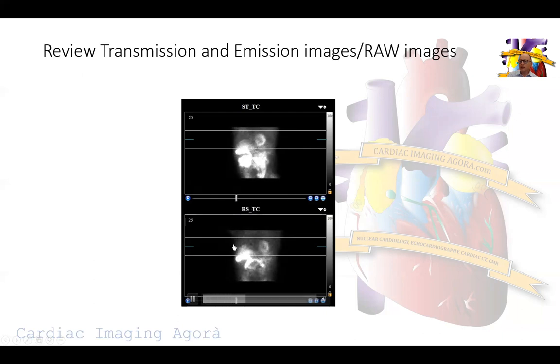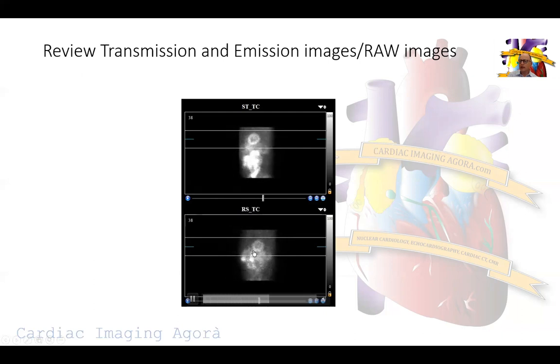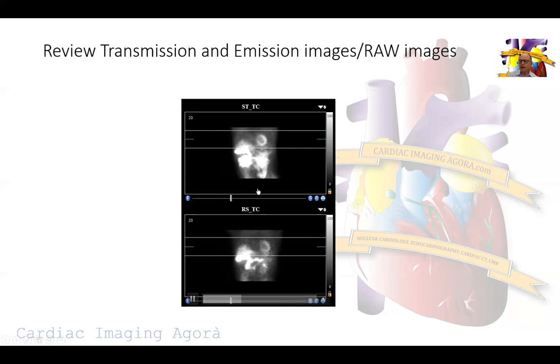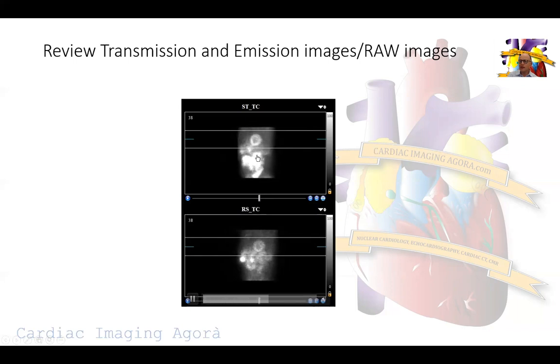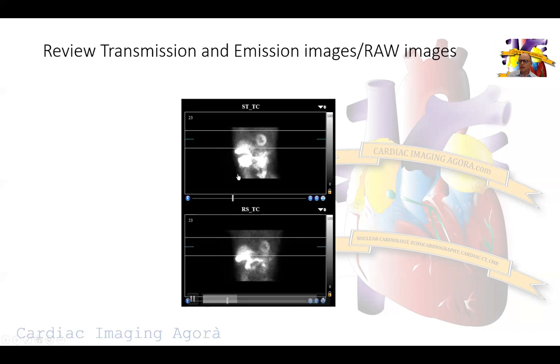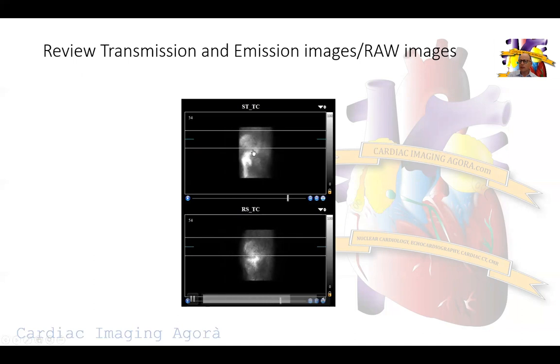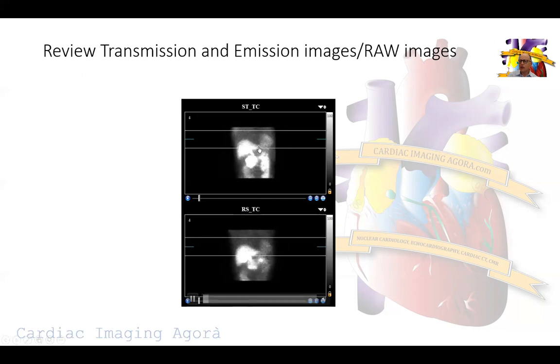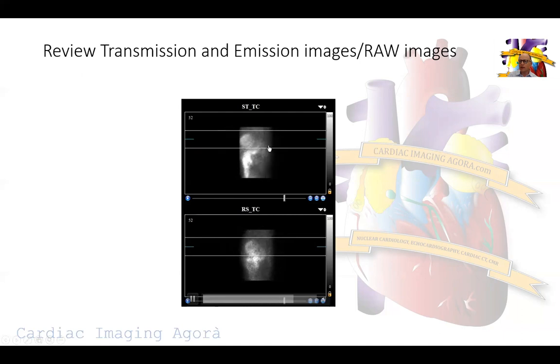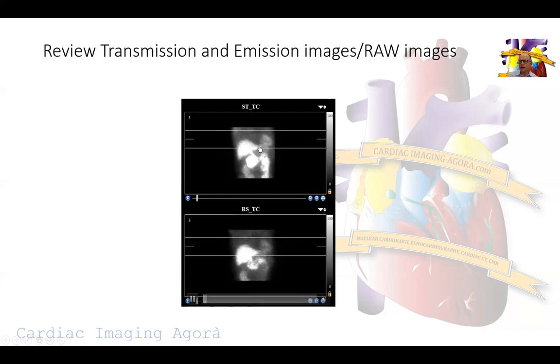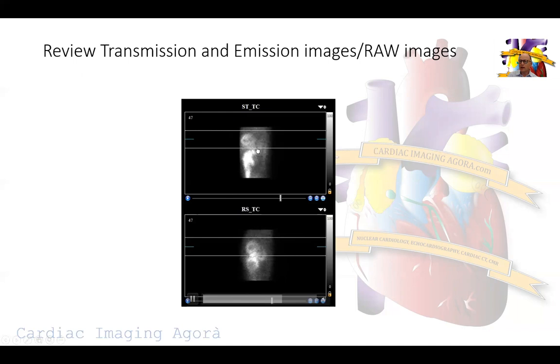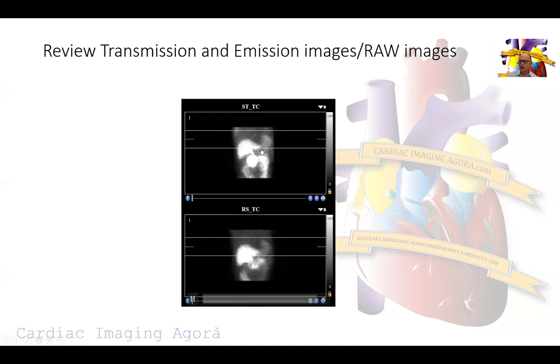You can see here immediately - on the rest images the patient was still and happy. On the stress images you can see significant patient motion in multiple planes. Not only did the patient move up and down, the patient moved sideways and repositioned himself during the test.